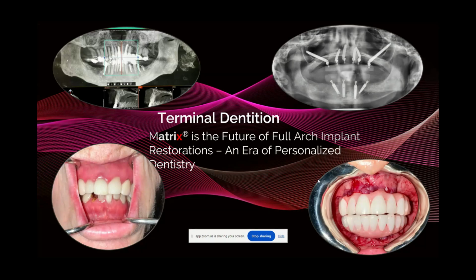So she came to me for the zygoma because the bone quality was quite poor. For the maxilla, bone quality was quite poor. So here you see that we did some zygomatic implants on her. I did some transnasals. The surgeon that originally referred her to me had recommended doing quad zygomas, but I felt like it wasn't necessary. Unfortunately, I see a lot of patients that are being overtreated in this day and age. I started placing the zygomatic implants 20 years ago when it was not popular, and now it's quite popular.